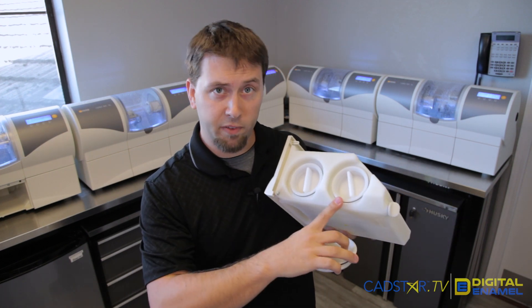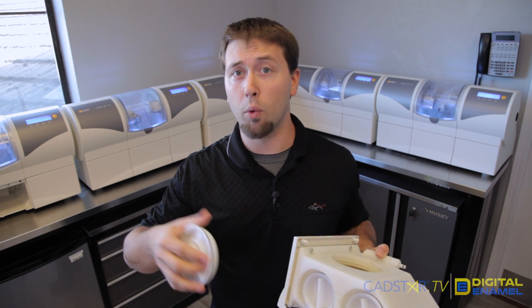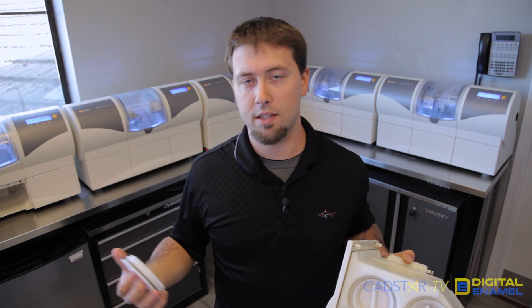Here you can see two filters. If you have only one filter, that's fine. Your provider will help make sure you get the right one for your MCXL, whether it's an MC, MCX, or an MCXL.